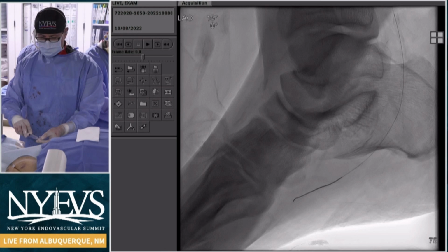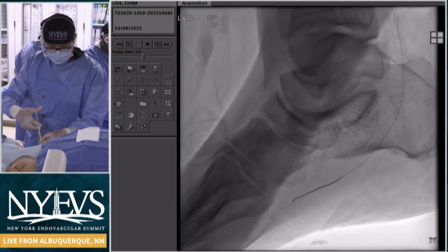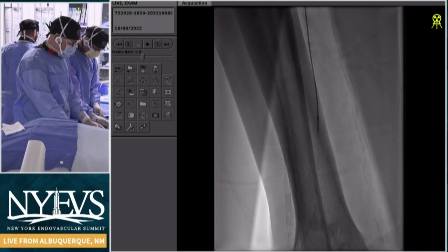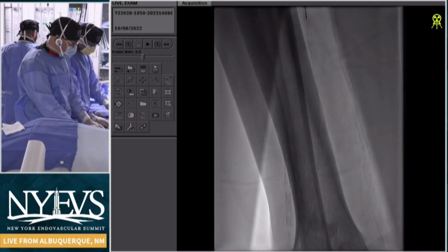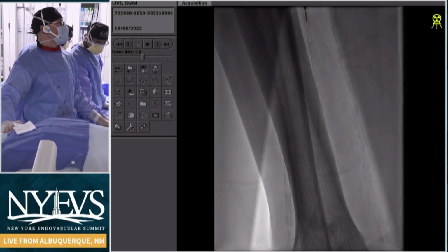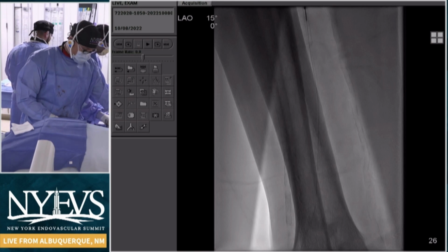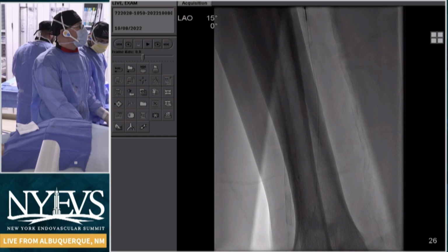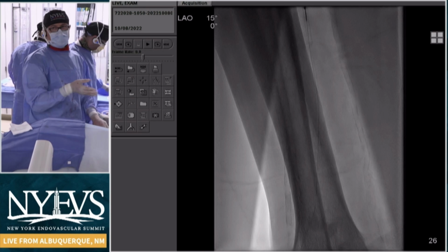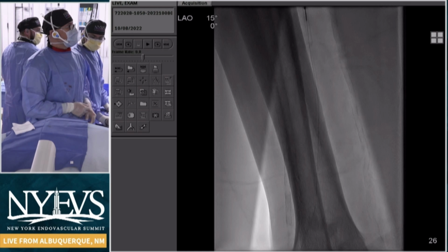Yeah, and I think the way to think about it is that you've got two options when patients don't have the final major outflow below the ankle, right? You've got pedal loop interventions and you've got DVA. So we got our posterior tibial to behave, and as you saw, whenever I can visualize the pedal loop, as to your excellent points on the panel about the ability to screw things up, I felt like we did what we needed to do, which was to get down the posterior tibial artery and then down to the common plantar, and I could see the split.